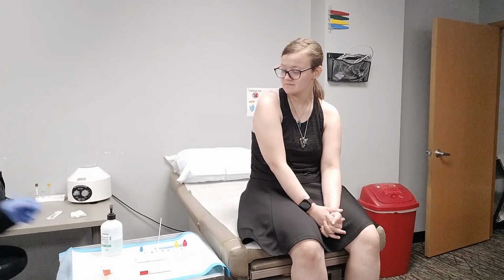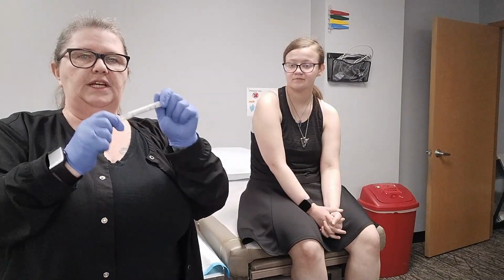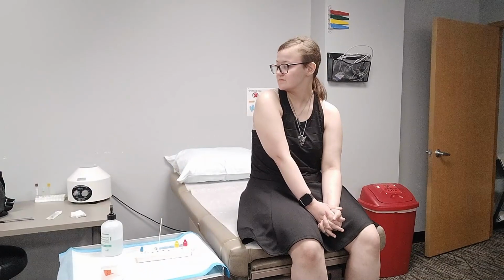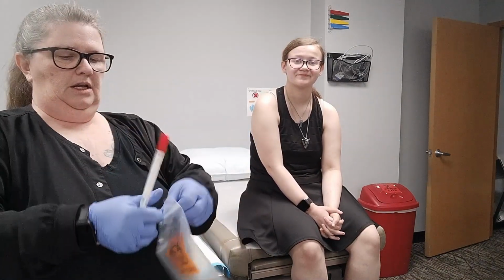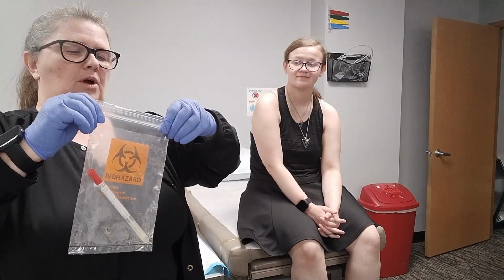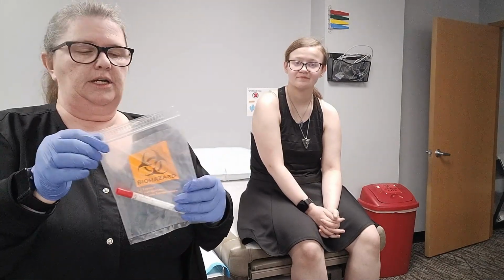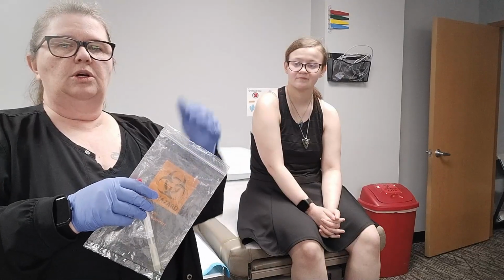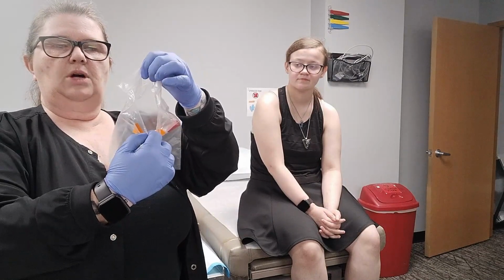And then we can go ahead at this point and stick our label on this, which will then go into a biohazard bag that goes to the lab. Once it's labeled, we'll seal that up. We'll either send the orders via EHR electronically, or we would have a paper requisition that we would put into this little pocket right here, and that'll go off to the lab.